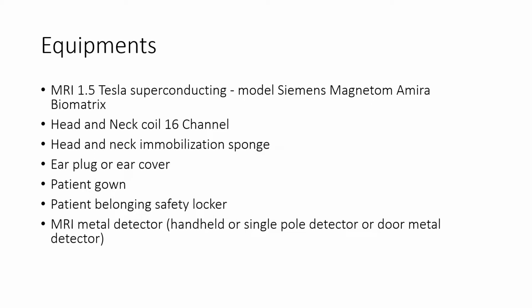We also need earplugs or ear cover, patient gown, patient belongings safety locker, and an MRI metal detector, either handheld, single pole detector or door metal detector.